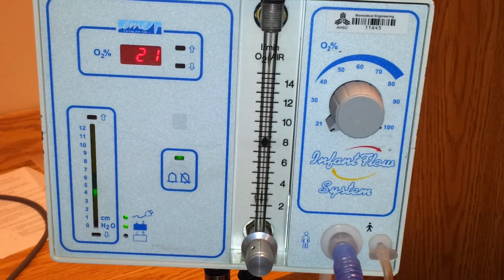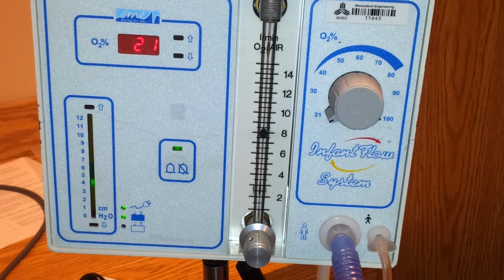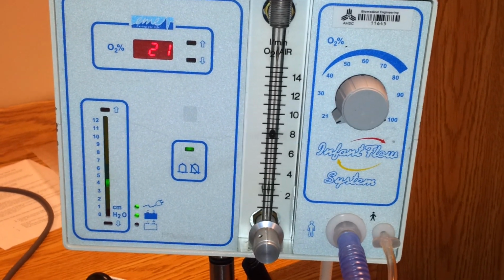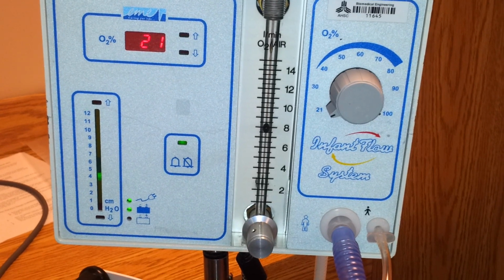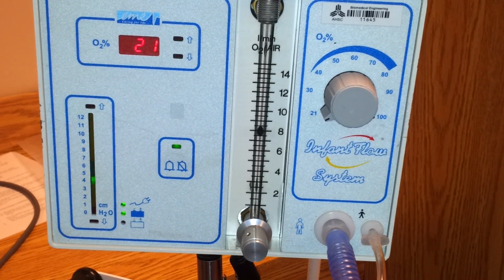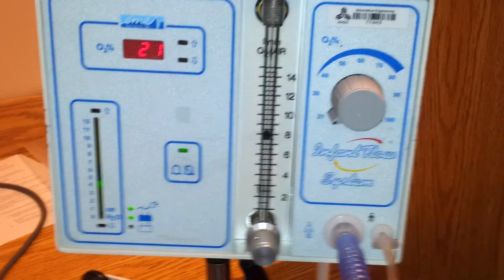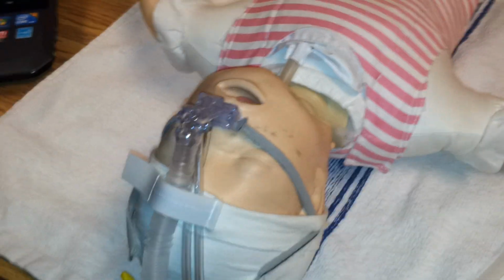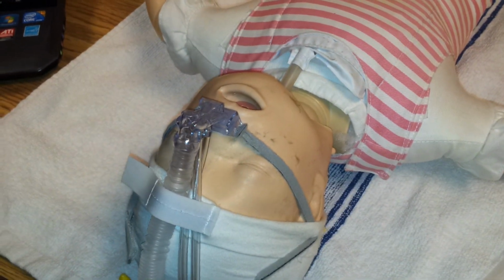You'll be expected, well, during the CBO, you'll come back and the baby will be in distress. So he wants you to look at 4 possible things. The biggest thing he wants you to check is if the prongs are blocked, if the baby has secretions. Even if the prongs are blocked, you will still hold the pressure of 4 to 5 PEEP.